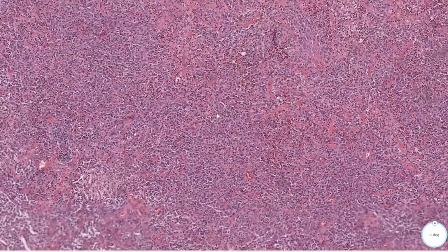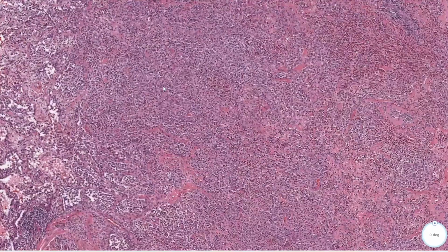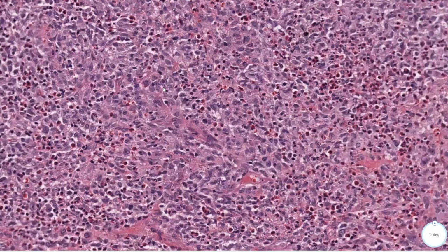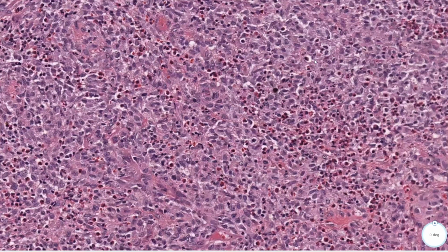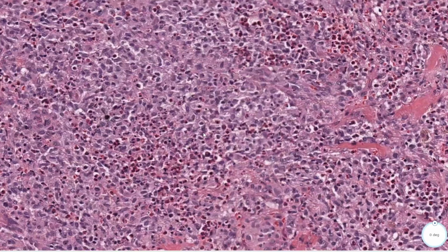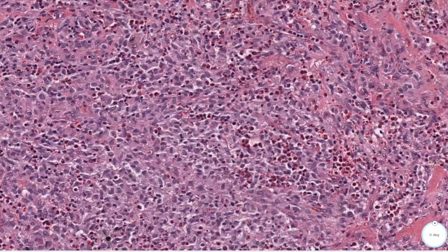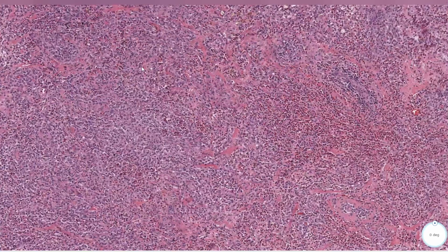And so this is typically a smoking related disease that is typically treated first with just smoking cessation. However, a subset of these cases can also have BRAF mutations, which may be important as some of these patients could be treated with BRAF inhibitors if they have progressive disease. So you can find a BRAF V600E mutation in approximately half of these cases.